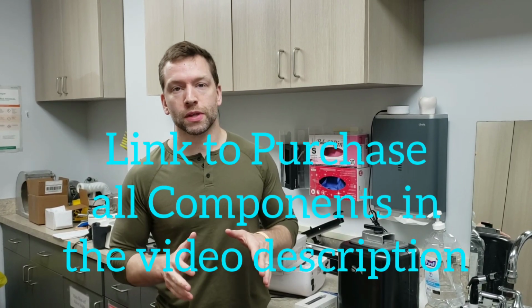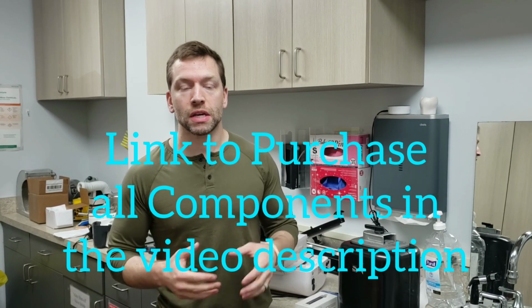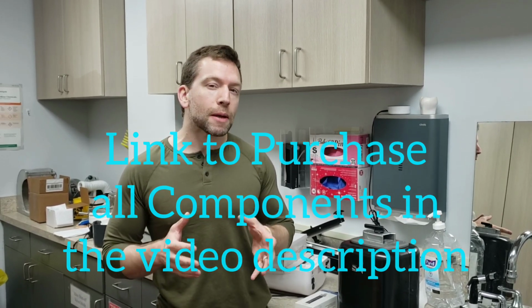Okay, so I've had a couple questions recently about my DIY, my homebrew cure unit that I use for the Sprintray Pro. So let me preface with this. I use this for models and surgical guides maybe, and otherwise we use our Pro Cure Unit, which I've shown before. It's by my printers, okay?